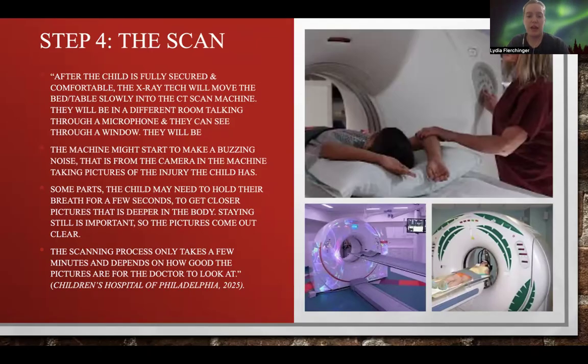At some parts, the technician may ask you to hold your breath for a couple seconds. It's not for very long, just for a couple breaths, so they can get closer to your pictures and get deeper into your body. And staying still is so important.